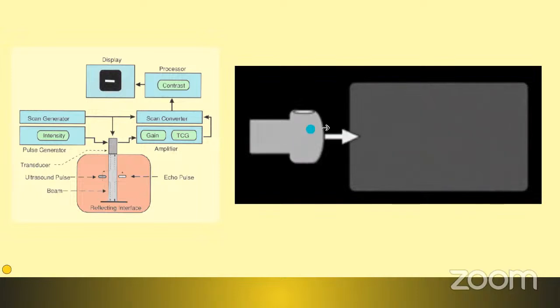So there's a chance that the attenuation would still happen. However, there's a higher chance that it will pass through the desired organ and thus I would get the image properly. So that is what we call gain function.